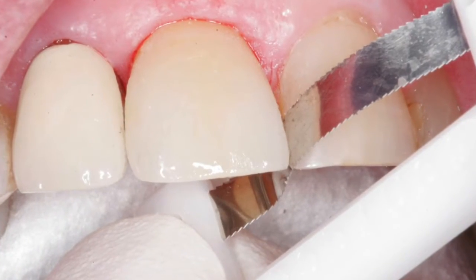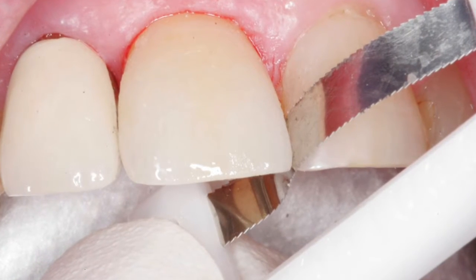It's a tooth file and we do it very precisely with a technique that I learned in my training called the Galler method. And it's using a series of small files, each one progressively larger.